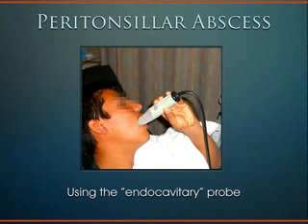So the tonsillar pillars can be seen on ultrasound quite easily. In fact, you can even see lymphadenopathy in the back of the throat in someone who just has a normal, enlarged lymph node reaction to having an infection in their throat. But you can also have an abscess cavity start to form adjacent to the tonsil, and this can be somewhat difficult to diagnose clinically because the patient may have a lot of redundant tissue in the back of their throat, and it's not as obvious. Sometimes it's very obvious: you see the uvula deviate to one side.